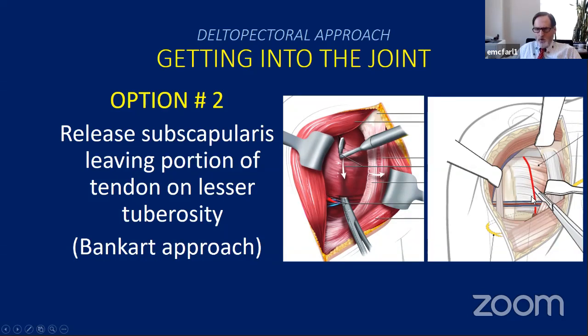Second option is to do a standard Bankart kind of approach, where you actually release the tendon and leave a tendinous portion on, leave some tendon on the humerus and some tendon on the subscapularis. I didn't think people use this much anymore, because the trouble is sewing back down just to the tendon is kind of meager. But I did do a narration of a case done by Joaquin at Mayo, and he still actually does this, but even when he does it, he makes sure that he secures this lateral portion in some fashion to bone as well. So tendon to tendon repairs like this tend not to be so successful.